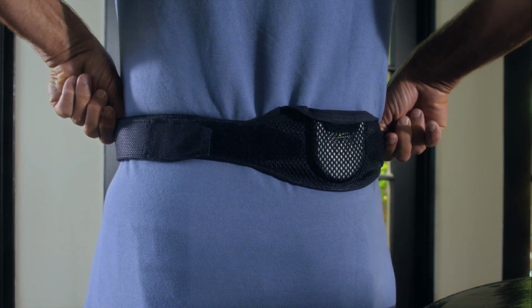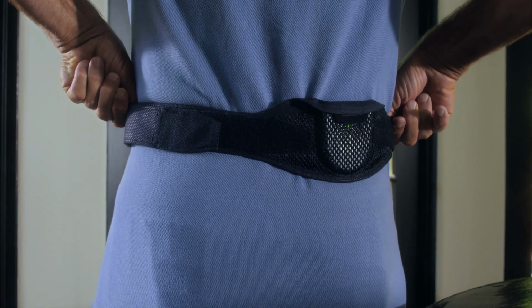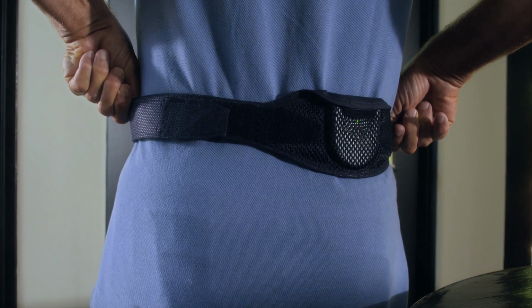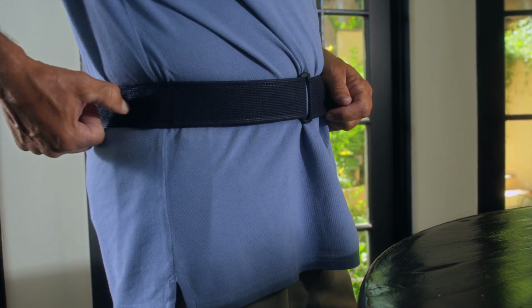The beeping stops when the charger is over the stimulator. The charger is looking to find your metal implant, and once it detects the implant, it will stop beeping. Tighten the belt once the charger is positioned over the stimulator.